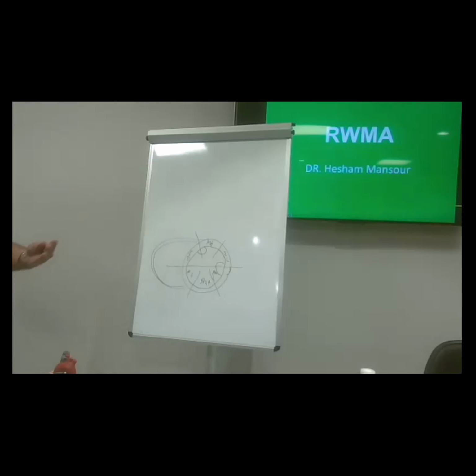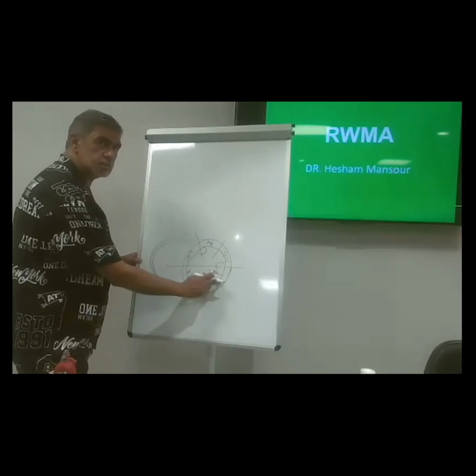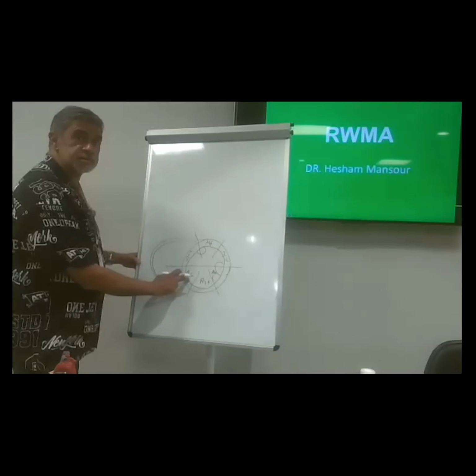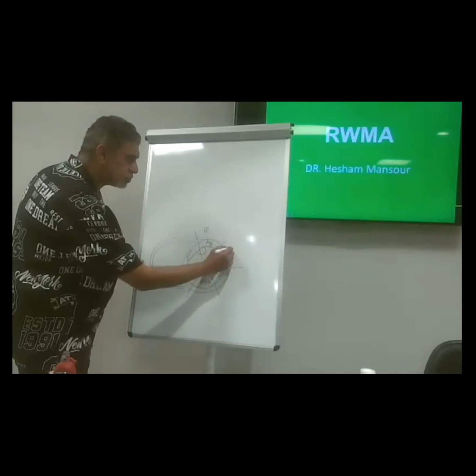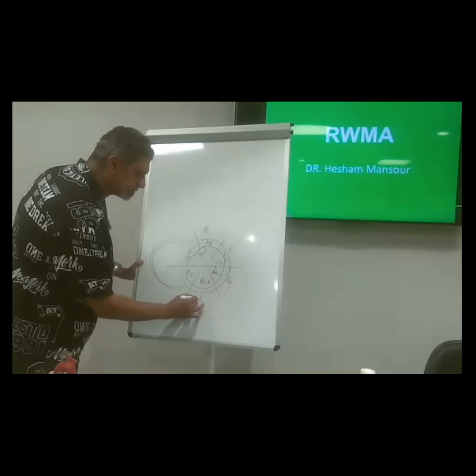Let us make it more simple, because if I jump to the head and ask him, what's this? Yes, he's still awake, alhamdulillah. What's this? Yes. This is at 12 o'clock. This is at 2 o'clock. This at 4 o'clock. This at 6 o'clock.